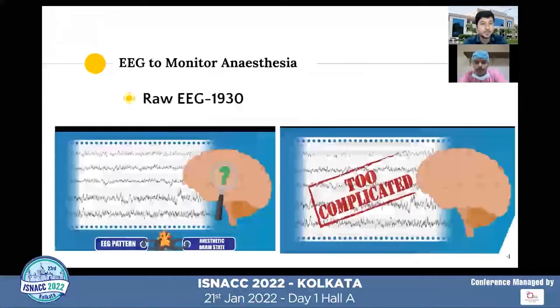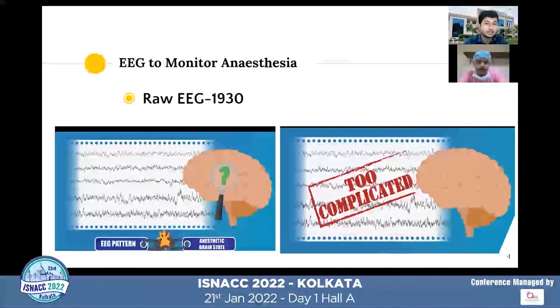So this table shows the target range of surgical anesthesia for various depth of anesthesia monitors, and we are familiar with all these numbers. Initially, in the early 1930s itself, they started using raw EEG to analyze the depth of anesthesia. Later they found out that it was too complicated because they were not able to find a relationship between the EEG pattern and the anesthetic brain state and the exact pathophysiological mechanisms. Many clinicians found it extremely complicated to analyze the EEG under anesthesia, and the raw EEG had so many external artifacts and external interferences. So the use of raw EEG for analyzing the depth of anesthesia gradually declined over the years.